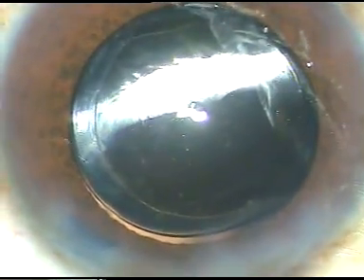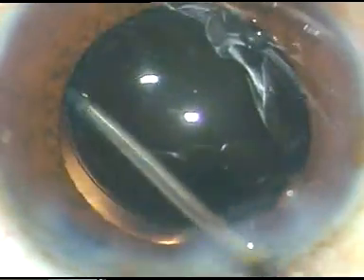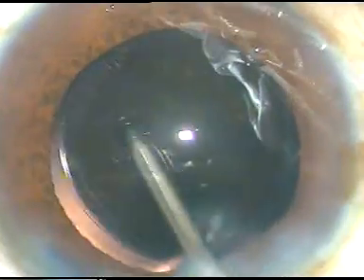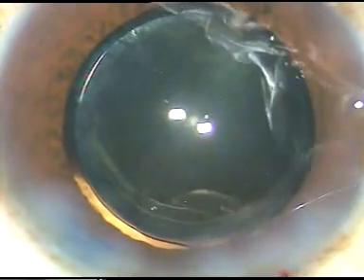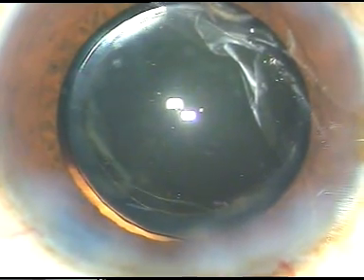That's it — the case is done. Since there is no viscoelastic substance, I don't have to clean it out. Now the side ports are hydrated. A final wash is made. The anterior chamber is formed and I conclude the case. This is how I form the anterior chamber.